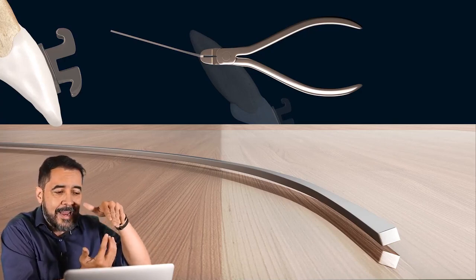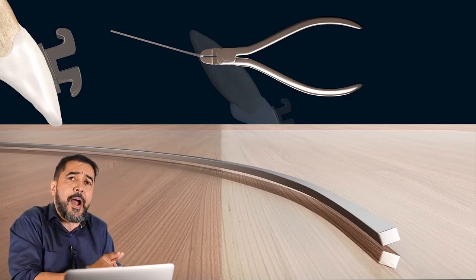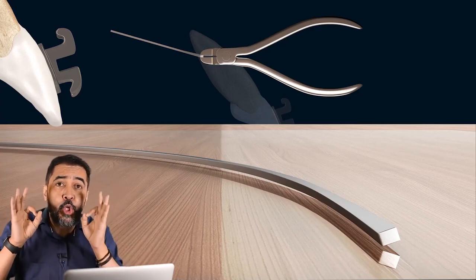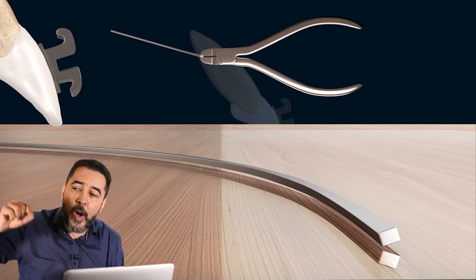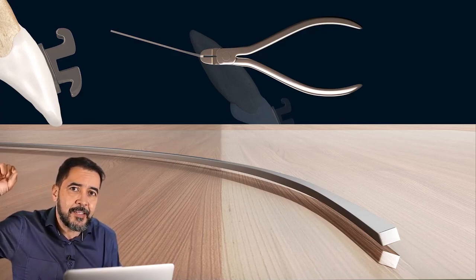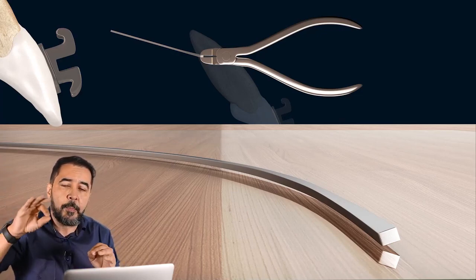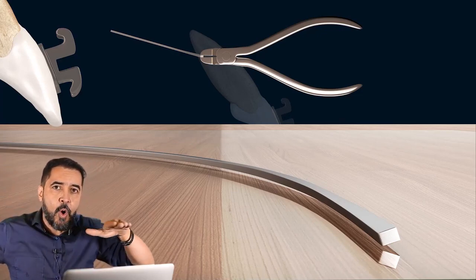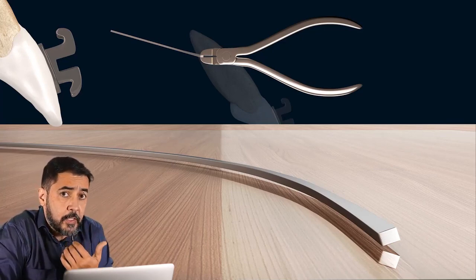So I can't insert a rectangular arch wire inside the slot without evaluating in what position it will pass in the posterior region, what position it will pass related to the level of the tubes and brackets in the posterior region of our dental arch.